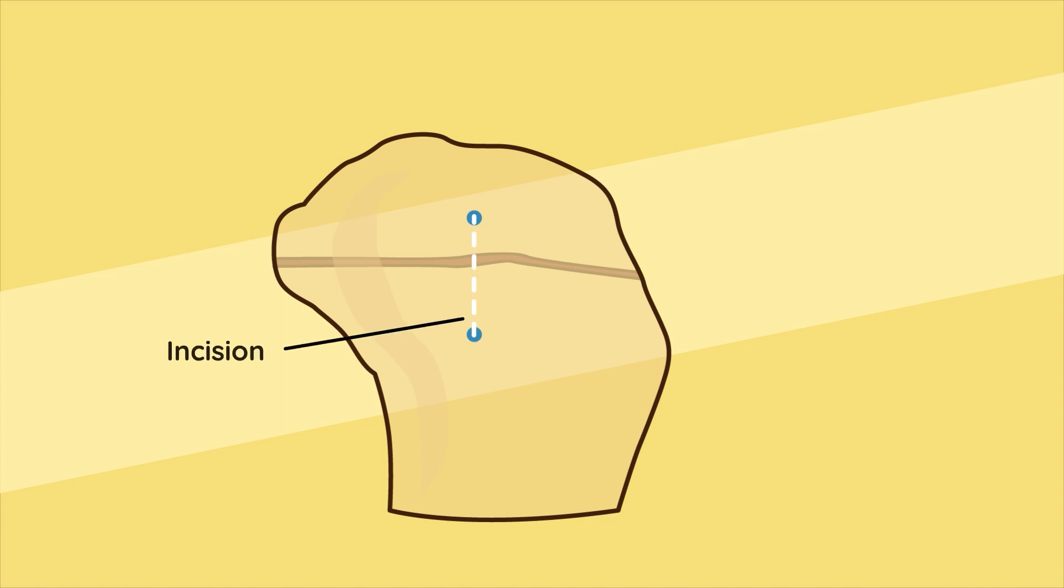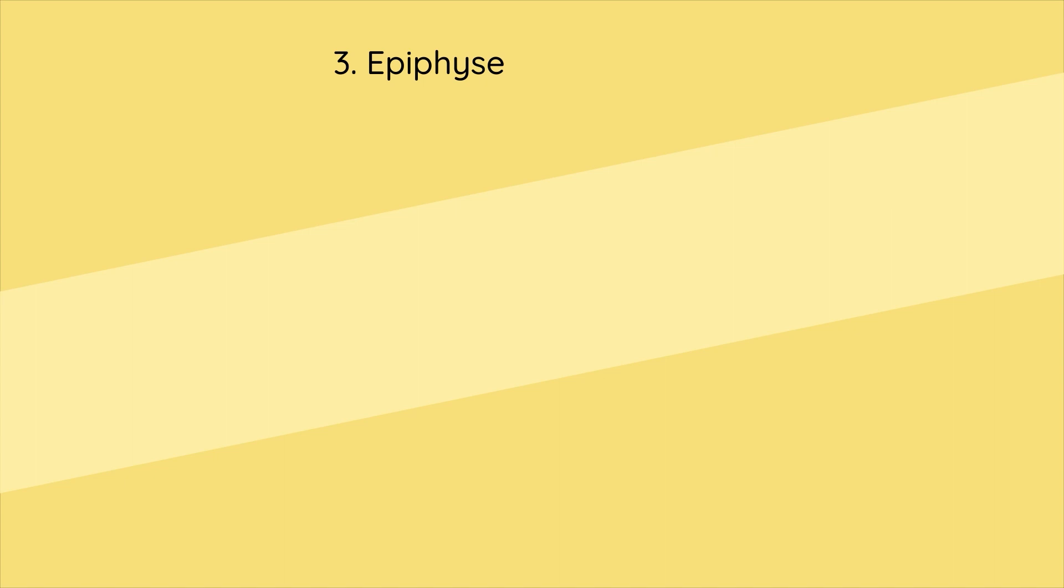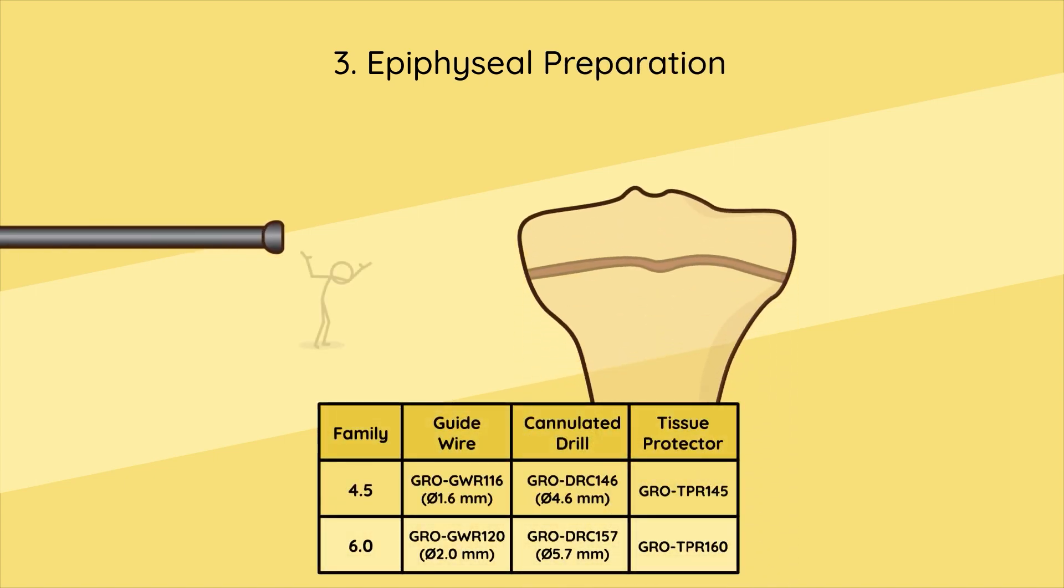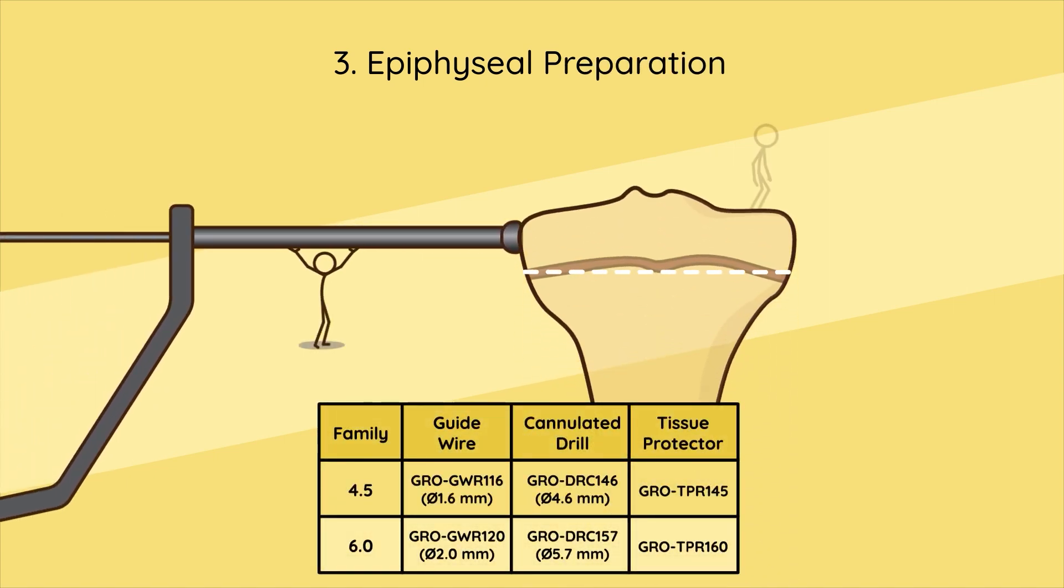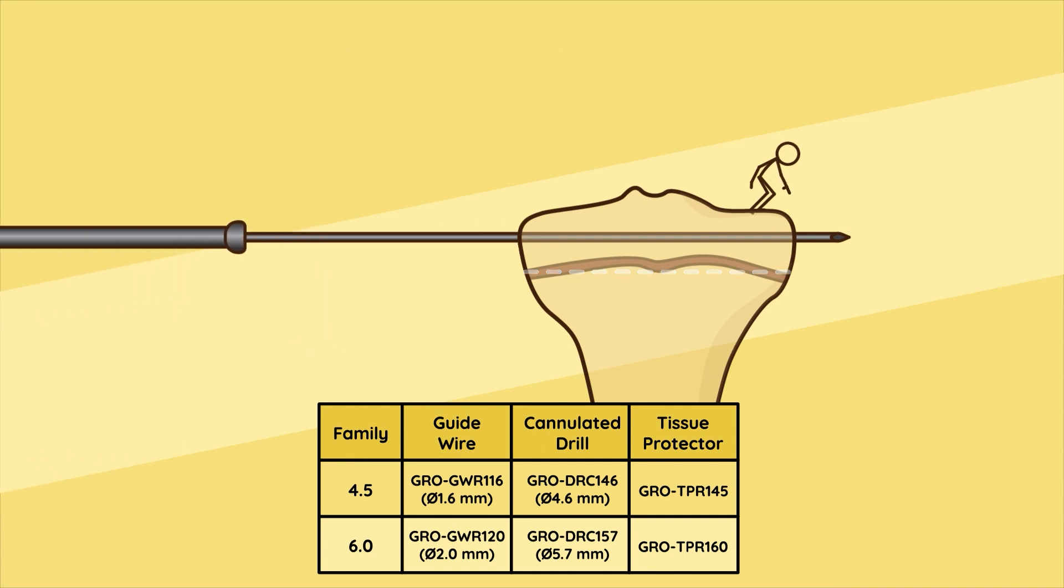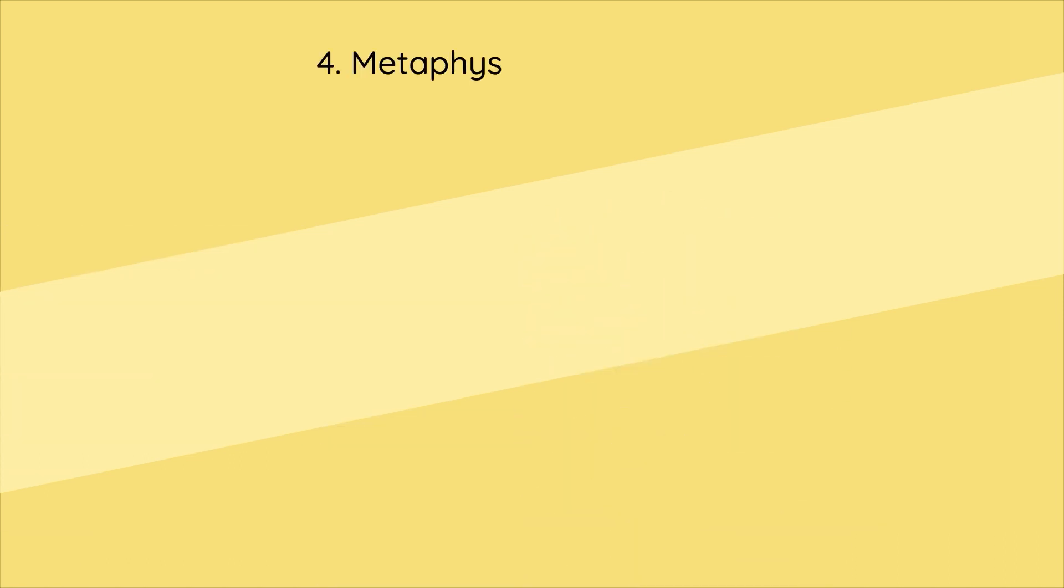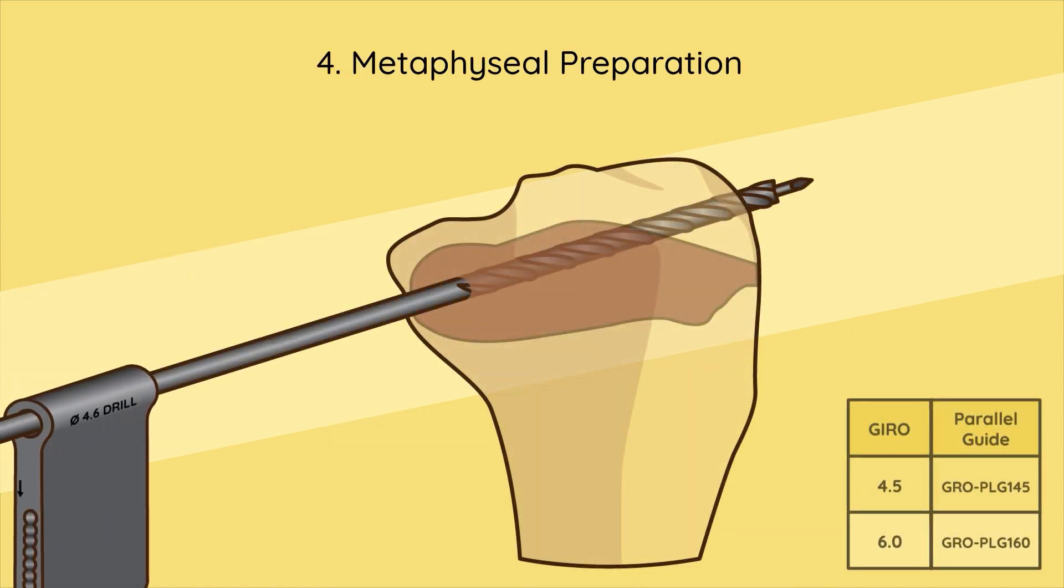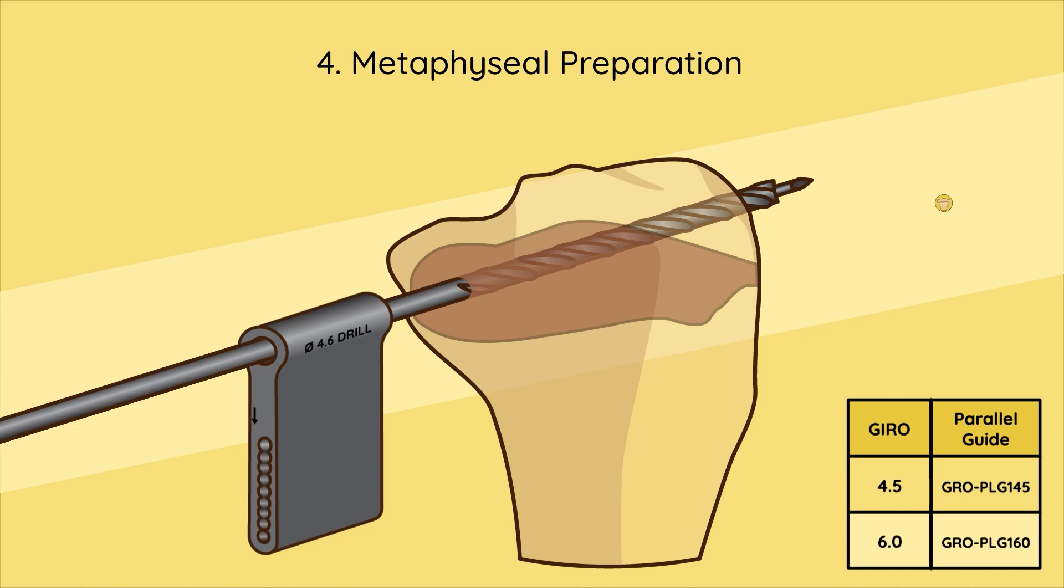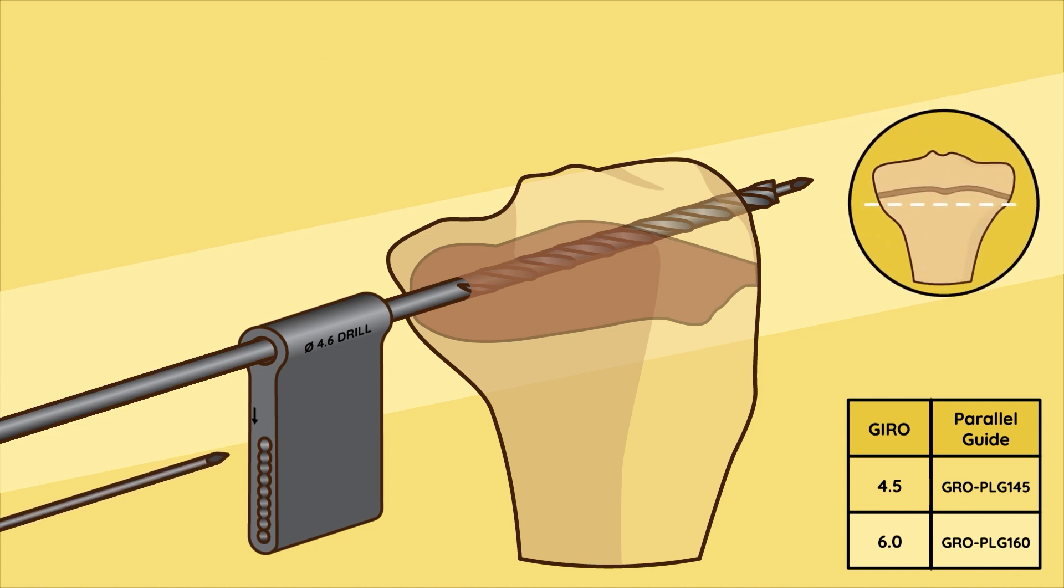Step three - epiphyseal preparation: Insert the guide wire parallel to the growth plate until it exits the opposite cortex. Drill the epiphyseal bicortical channel over the guide wire. Step four - metaphyseal preparation: Position the parallel guide over the drill perpendicular to the growth plate. Insert the metaphyseal guide wire into the bone cortex in the desired position.